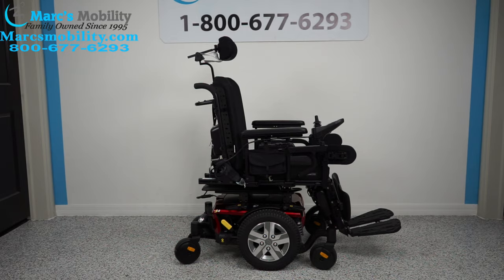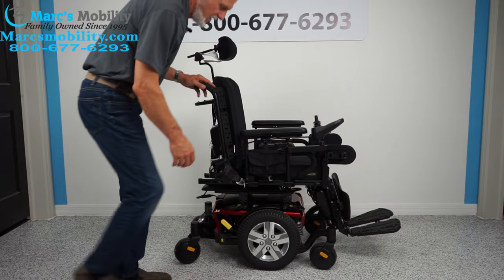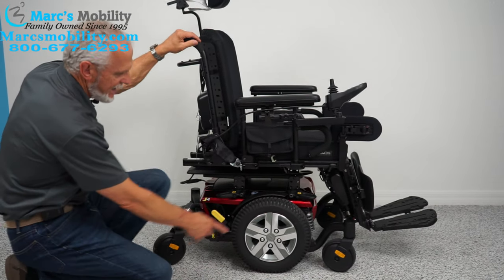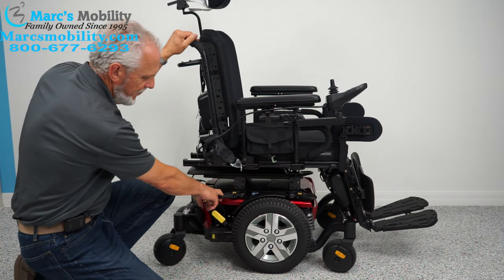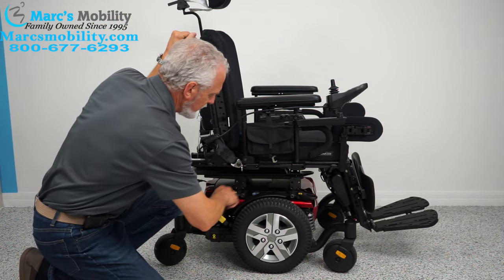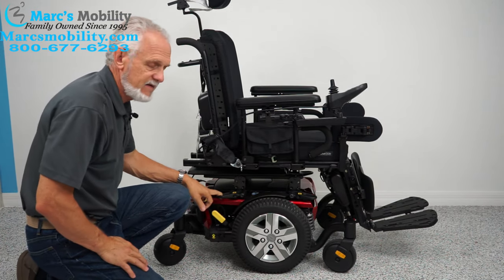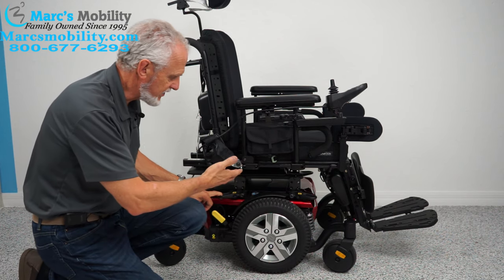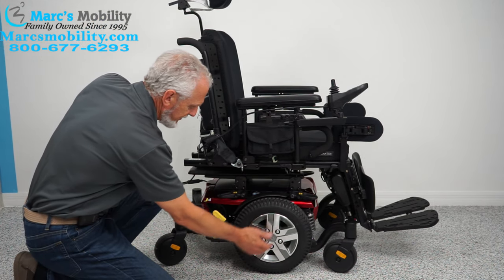Let's look at the base. You have 14-inch solid wheels, caster wheels in the back, and caster wheels in the front. You have heavy-duty anchor points — two on each side, four total. This is where you secure your chair to your lift or van if you need to transport it. Each wheel has its own independent motor.